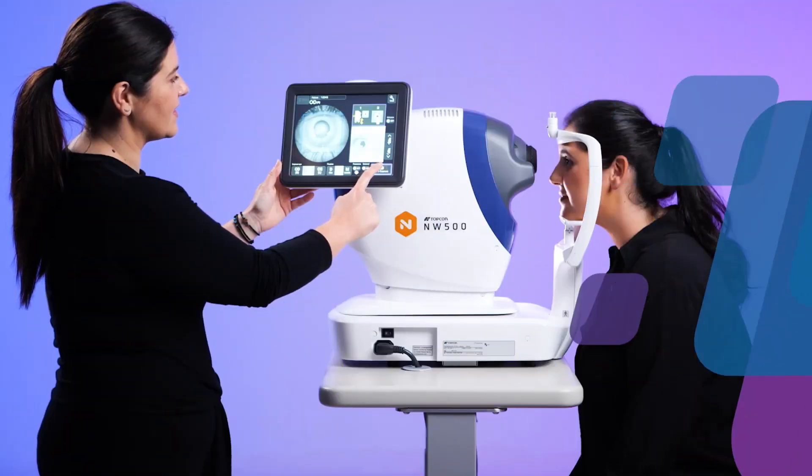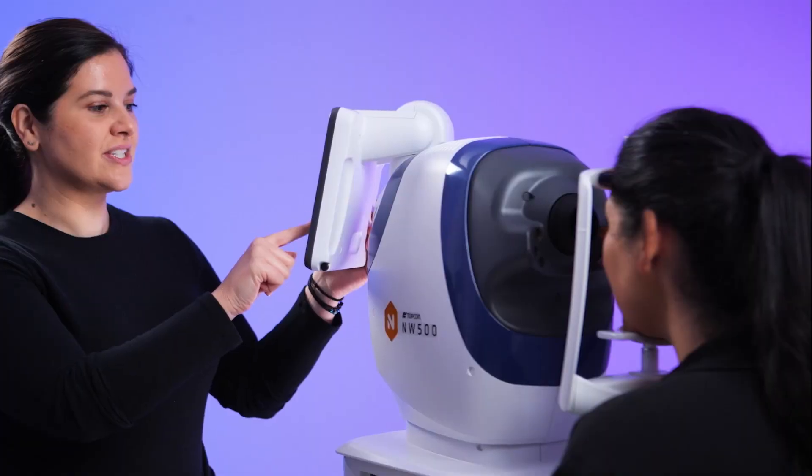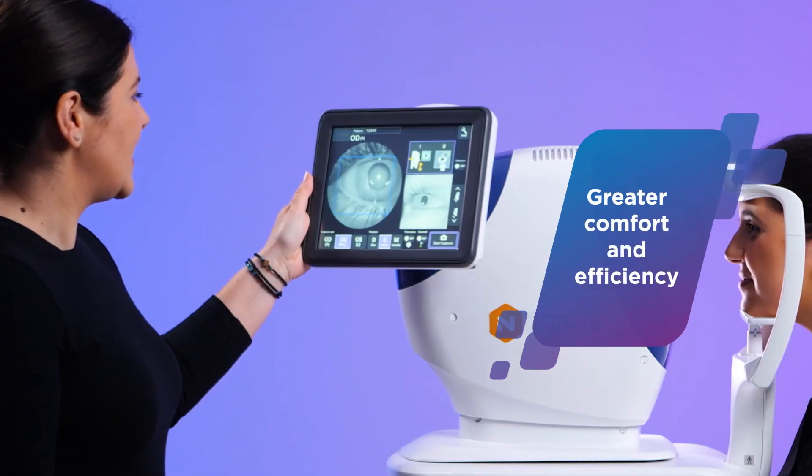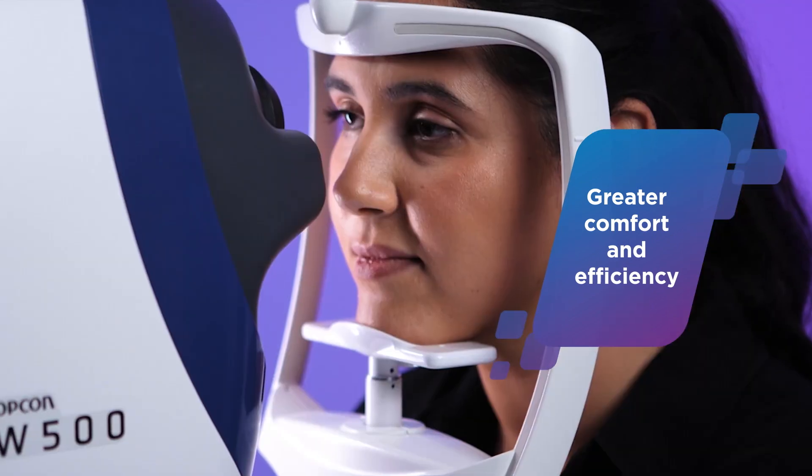As an added convenience, patients do not need to be dilated prior to imaging, thereby enhancing patient comfort and further adding to the overall efficiency of your clinical workflow.